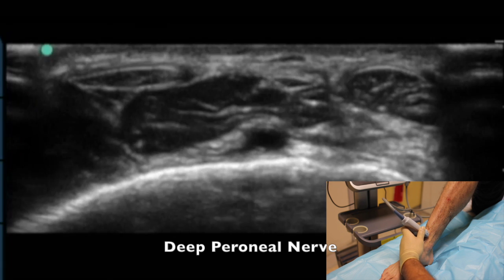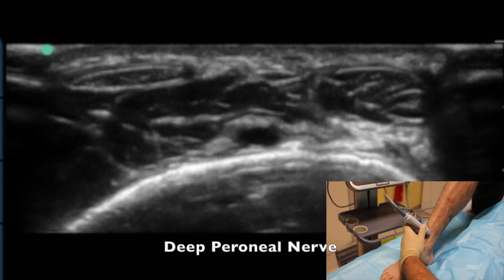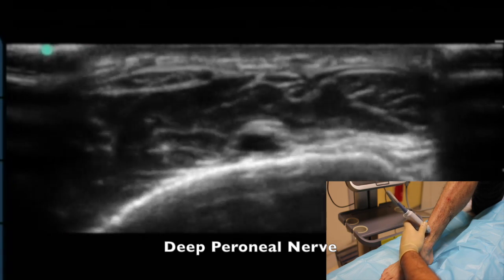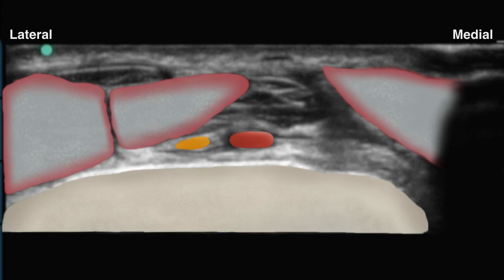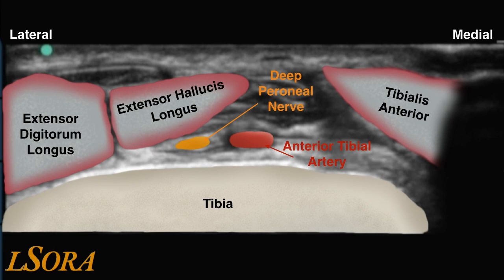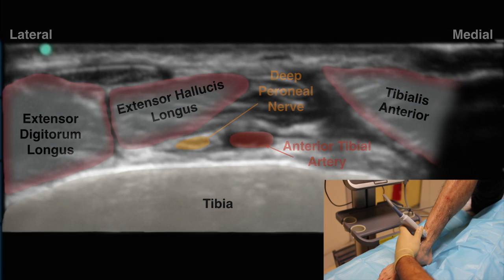To scan for the deep peroneal nerve, the probe is placed at the anterior aspect of the ankle. The anterior tibial artery is identified above the tibia, and a hyperechoic structure lying on the lateral aspect of the artery that slides over to the medial side with probe movement is identified as the deep peroneal nerve. Extensor digitorum longus, extensor hallucis longus, and tibialis anterior are also shown here for clarity.